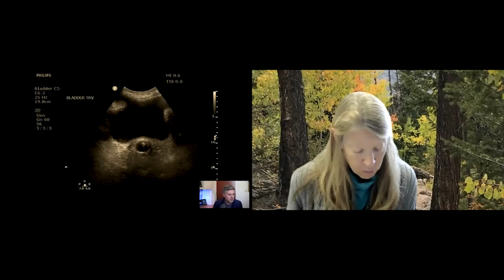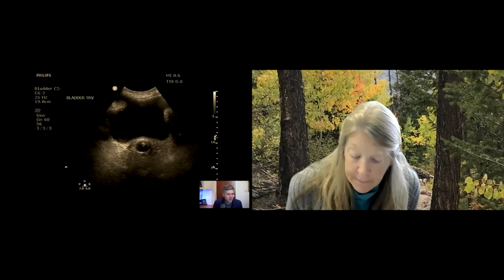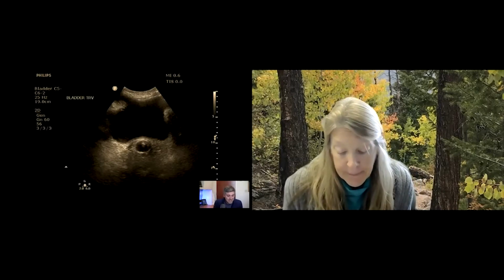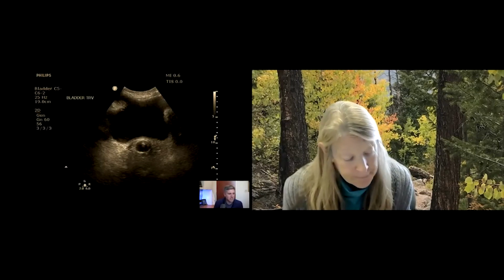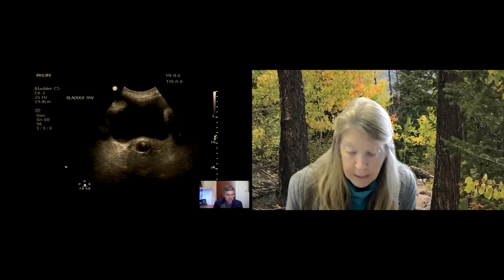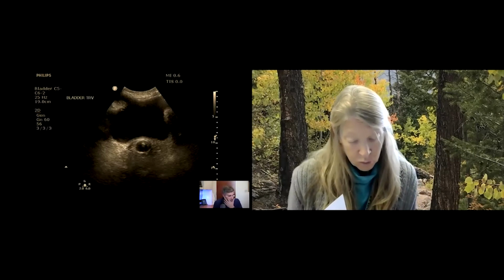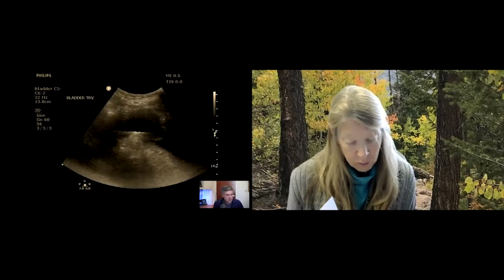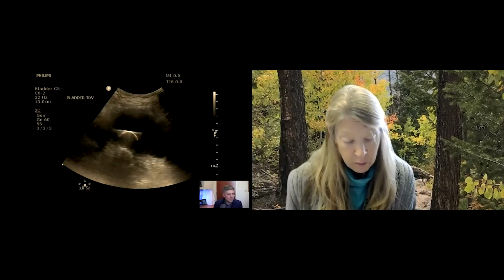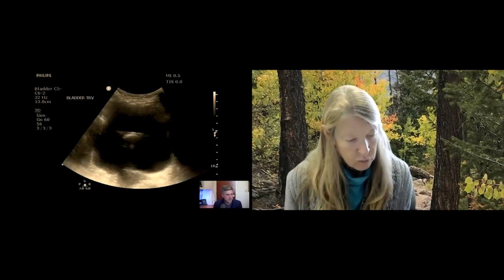Contrast that with this patient, right? So this patient had no Foley output or diminished Foley output. And when we scan, we find that the Foley balloon is well inflated, but it's not inside the bladder, right? You can see that large bladder in the near field, and you can see the small Foley balloon in the far field. And this one is inflated in the proximal urethra, right? And so if you deflate that and advance the balloon, then you can get the balloon inside the bladder, and you can see the example of that here, where now you have a Foley that's inside the bladder, right?